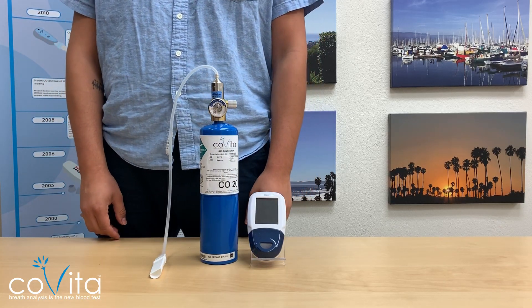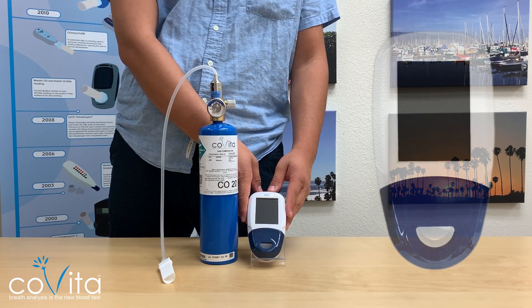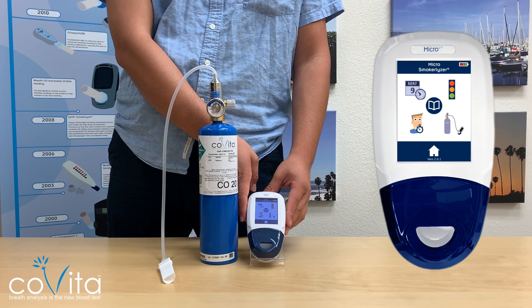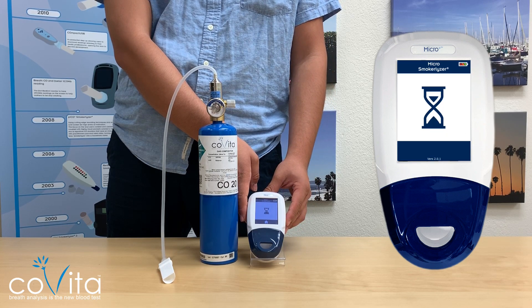We are now ready to calibrate. Now that our calibration kit is assembled, we can turn on the monitor and press the gear icon to get to the settings menu. Once on the settings screen, press the icon that resembles your calibration kit to begin pre-calibration zeroing. While zeroing, the monitor will display an hourglass. Once zeroing is complete, the monitor will show assembly of the calibration kit.